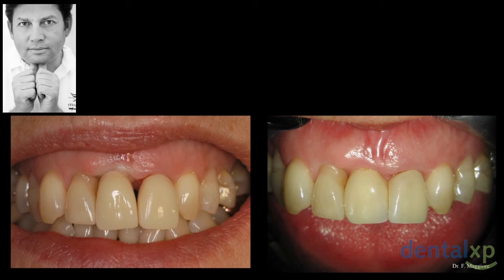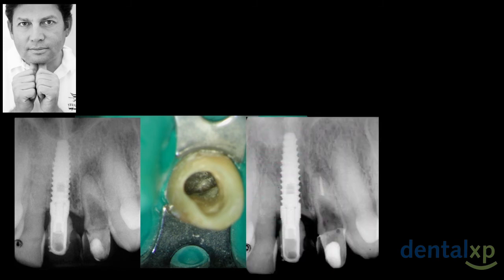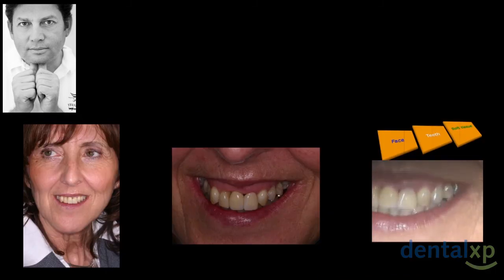We can still have the soft tissue growth if we position at 30%. We provoke a recession. But look what happens. After I change everything in the lab, okay, sorry for that, we change everything in the lab, we can put it back, see? Then the soft tissue grows in, the midline is changed, and now we have to see how this will be delivered. The day of delivery, the patient wasn't happy because the papilla wasn't there.